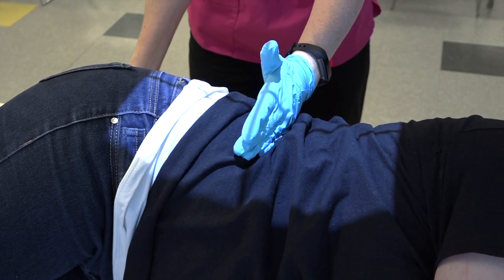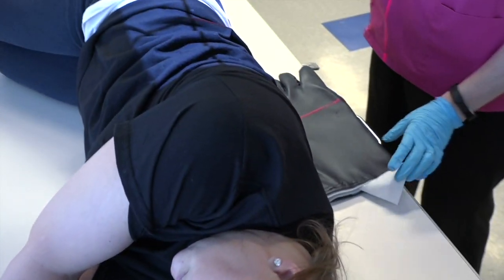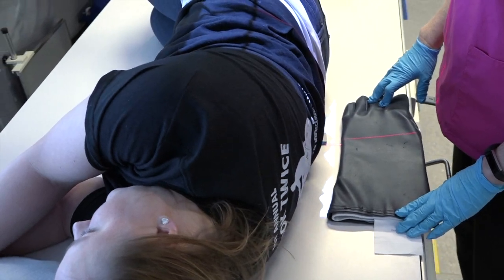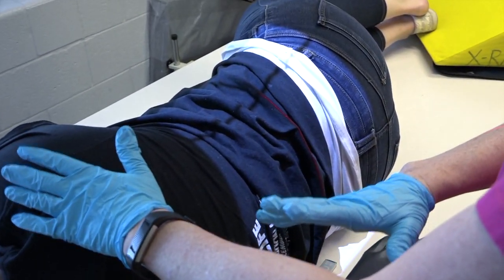We're going to move back just a tad and put your left marker in the light. And we always want to put a lead mat behind the patient. It absorbs the scatter and helps with image quality. Okay, and we'll shield the patient where we can.